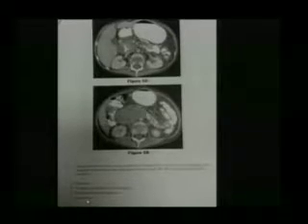Is this pancreatitis? This is the pancreatic head right here. This is not the pancreatic head. What is this big old thing? It's the same thing as this. He has leukemia, had an endoscopy, and now has pain. It's the intramural duodenal hematoma. It's not perforation. There's no free air. We don't have extravasation of this contrast going out here. It's not pancreatitis. Nobody knows what scleroma is. I'm going to tell you what it is in a second. But that was a duodenal hematoma, intramural, so this is pushing on the lumen, and it's causing that crescent shape.